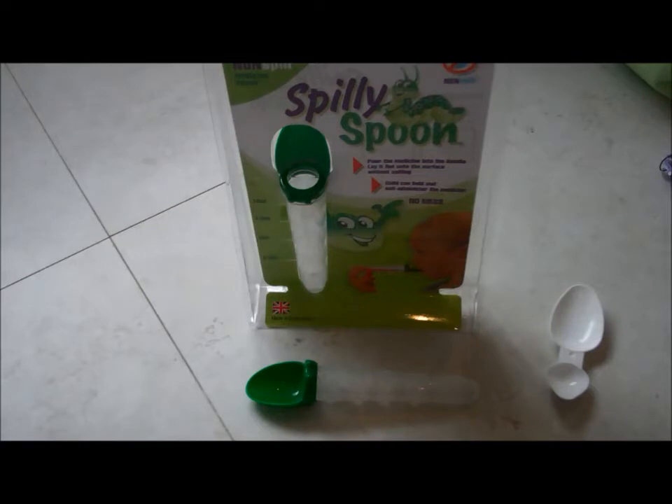This is a Nappy Lady demonstration of the Spilly Spoon Medicine Spoon. I love this amazing product — it's very simple and solves a very annoying problem that we've had in our family.